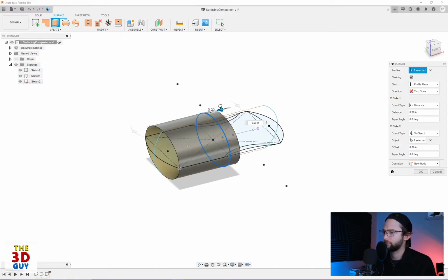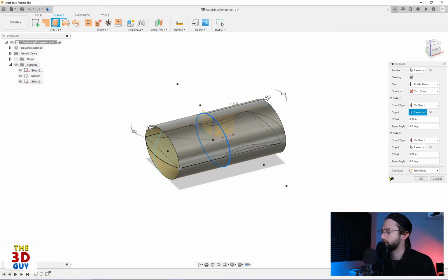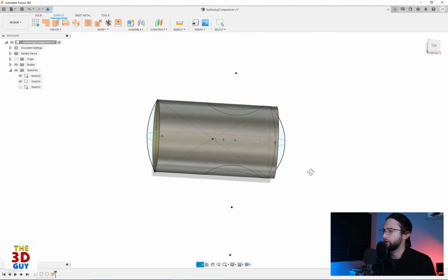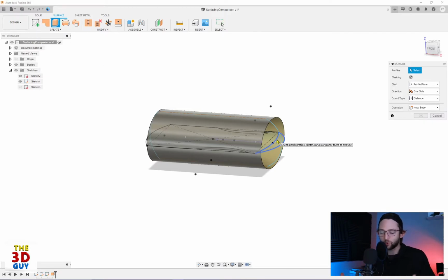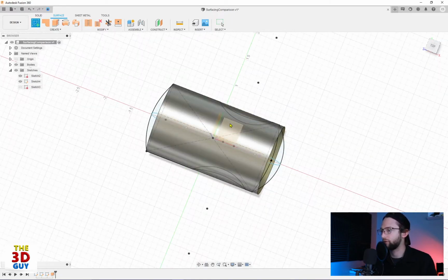Hey, come on. There we go. Awesome. We don't need that sketch anymore. We'll get that out of the way. And so right now, we're just going to pretty much do the exact same process. So again, you can see right now it's selecting more lines than we want. So we're going to have to create some new sketches and then just copy it from there.